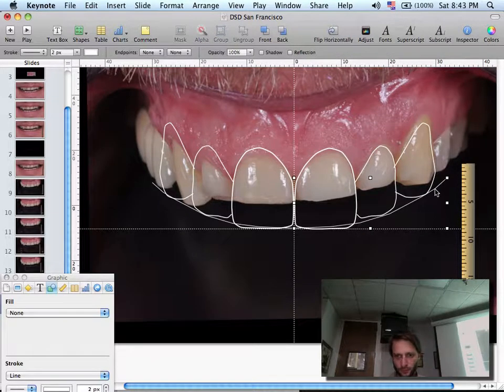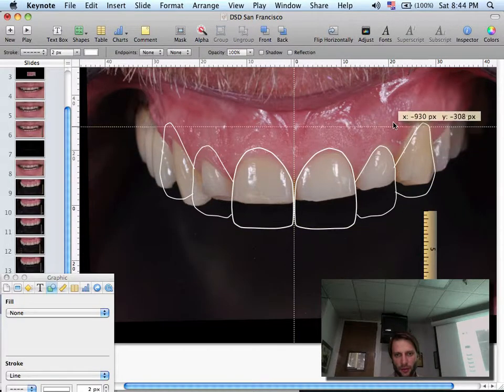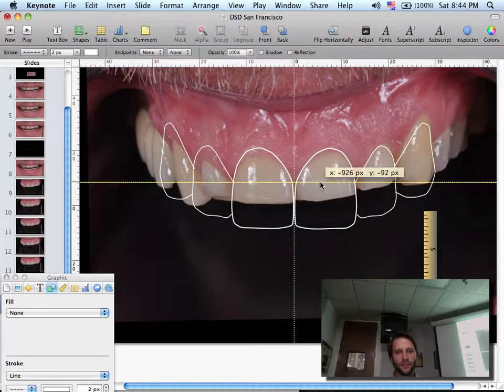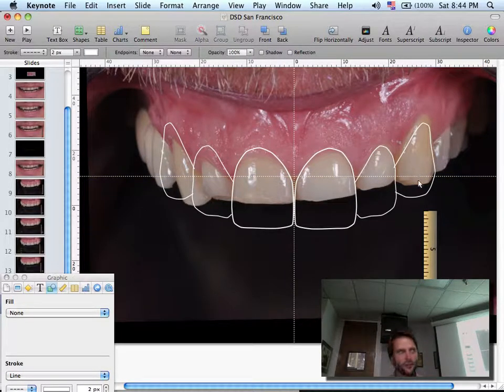Then I can delete the curve and I can measure. I already have the cross on the model. If I don't have the cross on the model, I can bring this up over here and make the same measurements that we did before. Before, what we did, we placed the line on top of the teeth and we measured the distance between the line and the incisal edge.